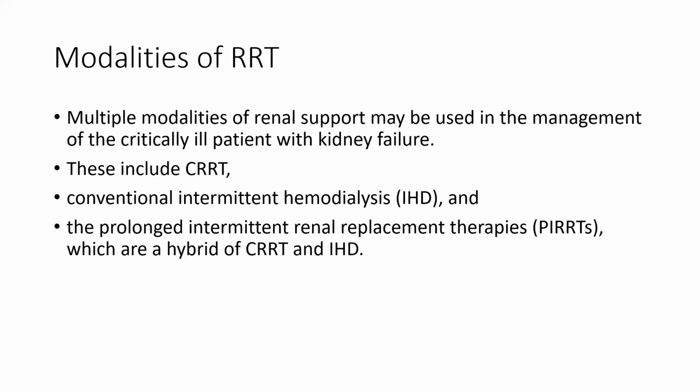So first we'll understand what the modalities of RRT are. Multiple modalities of renal support may be used in the management of the critically ill patient with kidney failure. This includes CRRT, conventional intermittent hemodialysis, and prolonged intermittent renal replacement therapy, which is a hybrid of CRRT and IHD.